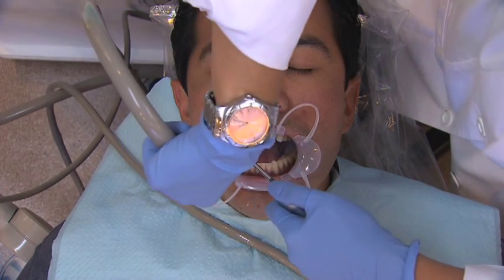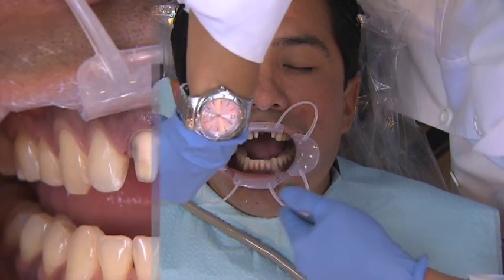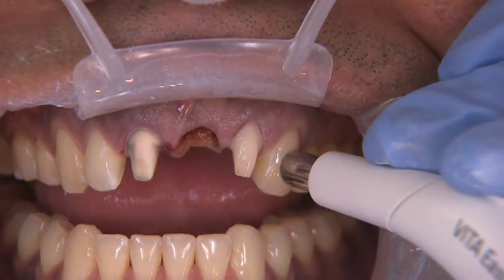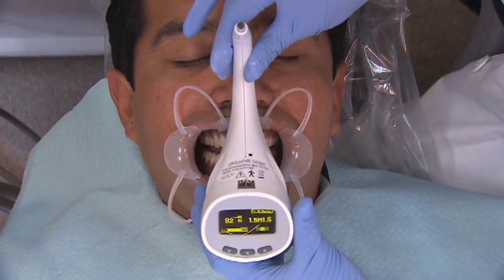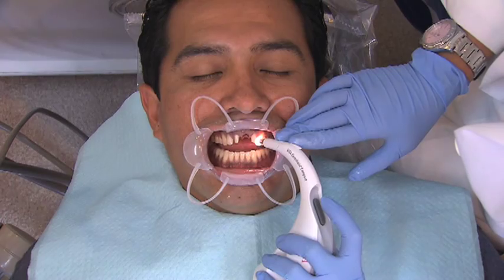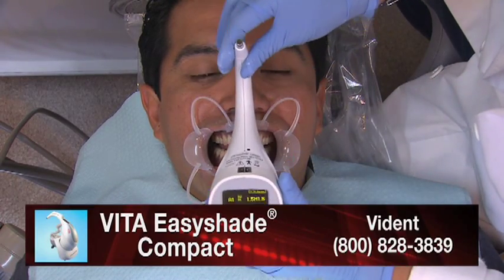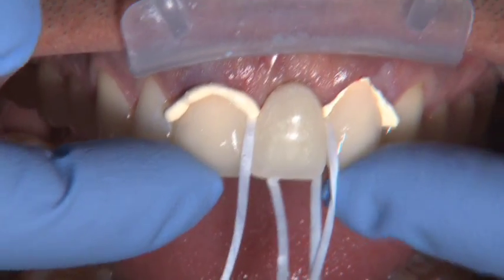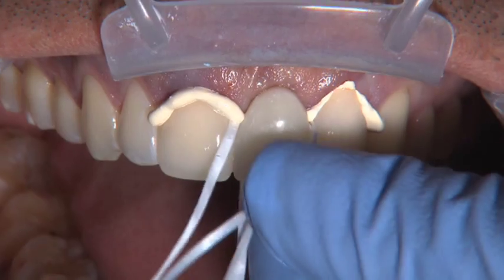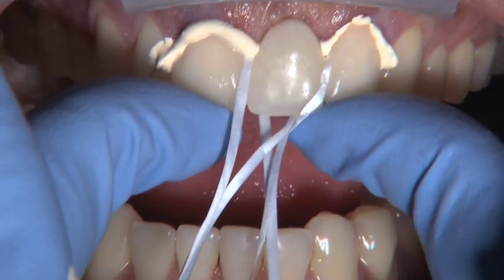She's got her three scans for the opposing arch, and then that powder just rinses right off — it's pretty simple. Doing digital scans like this in the anterior is a little bit easier than doing it in the posterior, but it worked just fine here. On this case, we're using our Vita Compact Easy Shade on the adjacent tooth and getting B2 at the junction of the cervical third and middle third, and an A1 in the incisal third.